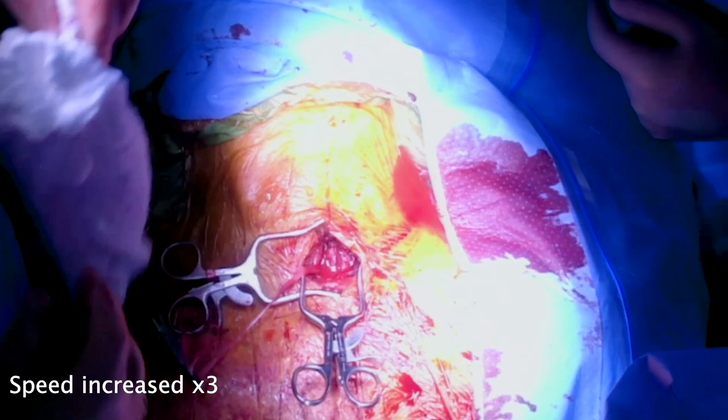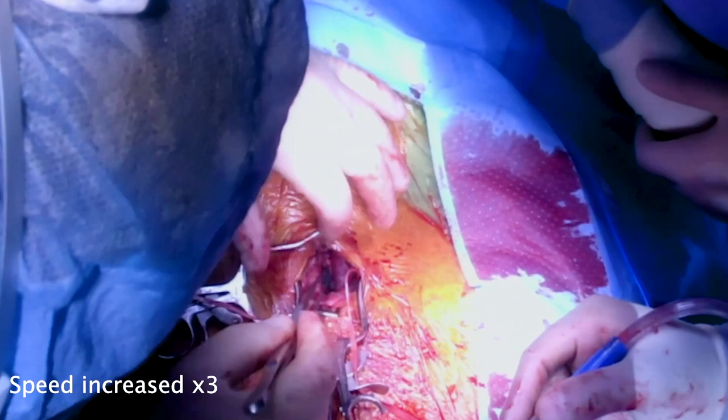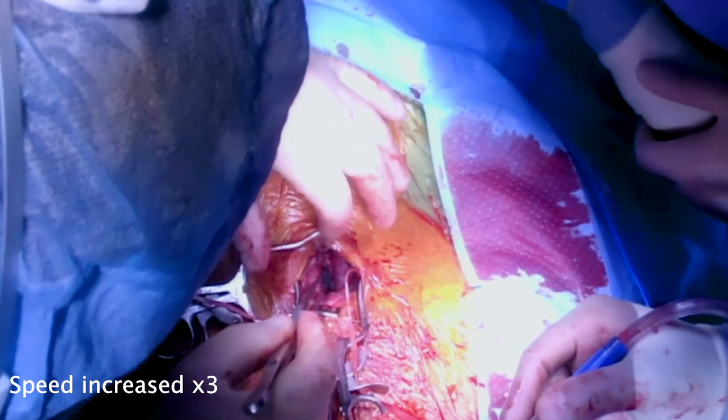After adequate hemostasis was reached, the left neck wound was closed in a standard fashion and the venous sheath was removed. The patient tolerated the procedure well and moved all four extremities to command.